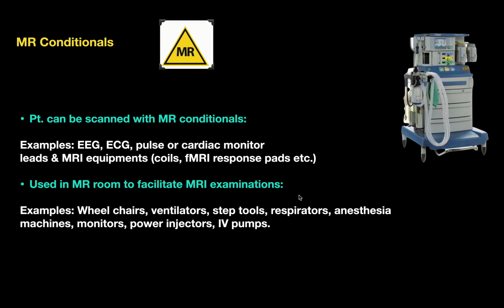MR conditionals are also used in the MR room to facilitate the MRI examinations, and examples are wheelchairs, ventilators, step stools, respirators, anesthesia machines, monitors, power injectors, and IV pumps. So these are the MR conditionals.